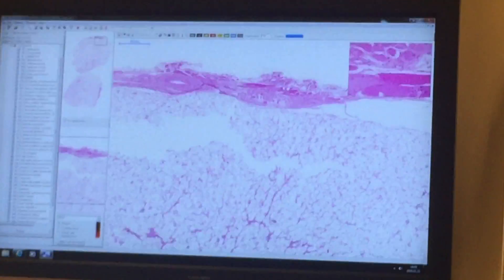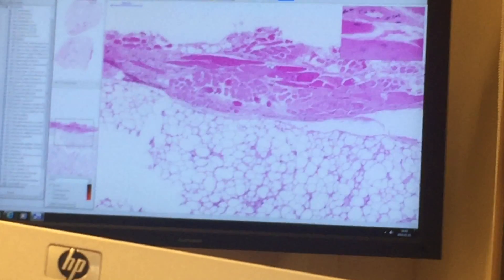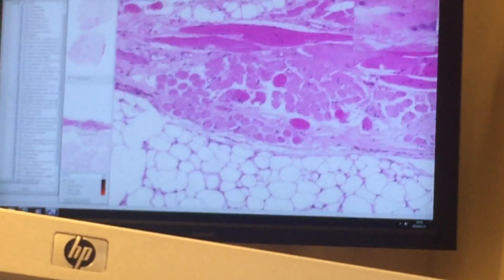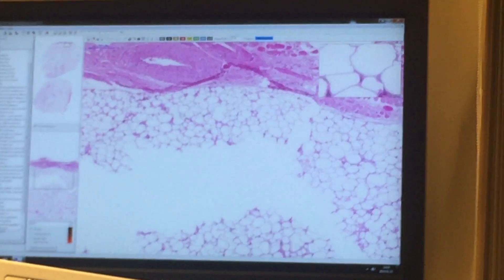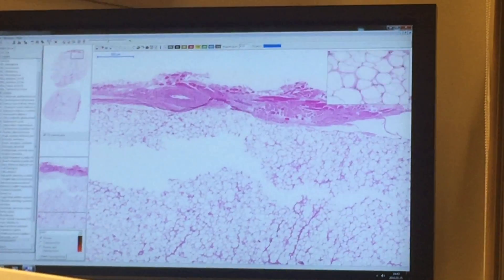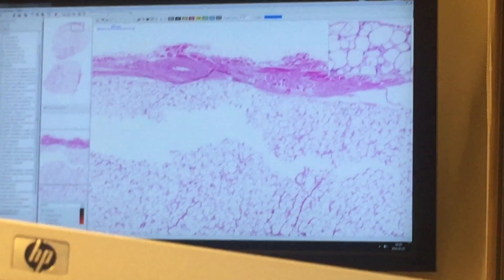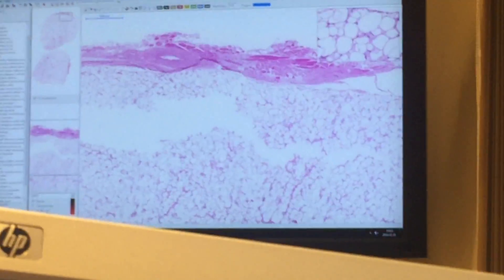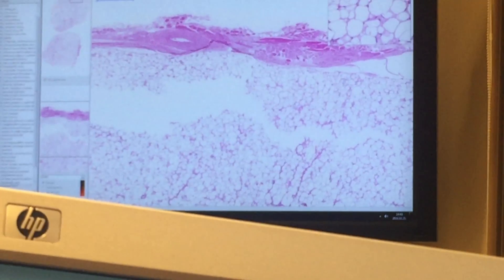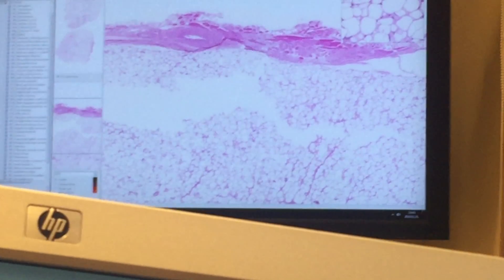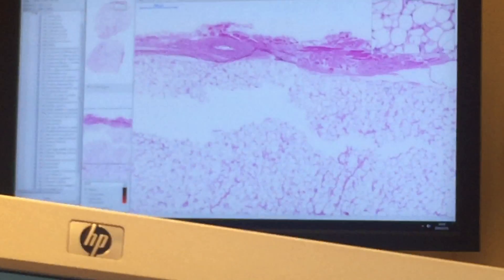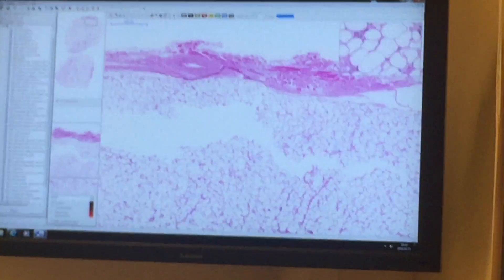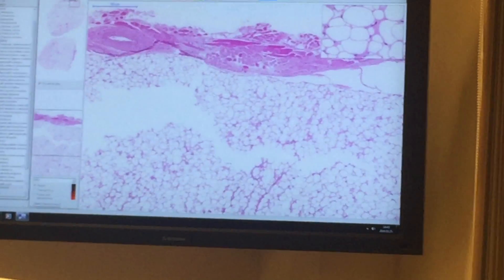At the top there is some surrounding soft tissue, skeletal muscle fibers, and a big vessel next to it as well. You can see there is no capsule or connective tissue around or dividing these two areas, but the fat is well demarcated from the muscles. So, no capsule.